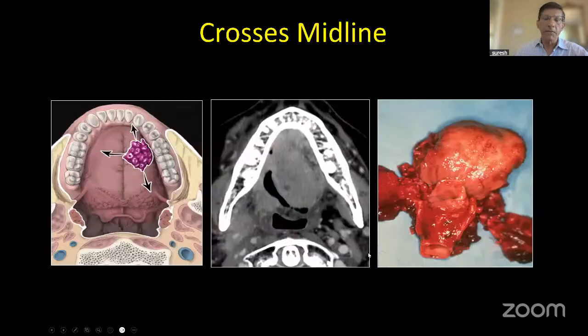But on the other hand, if we have a tumor such as this that's completely involving the tongue, so when we have a tumor like this, we're talking about this spread pattern that crosses midline, then you really have to have an interesting discussion, especially now in 2025. Because if this tumor crosses the tongue, then the surgeons always want to try to get a 5 to 10 millimeter oncologic margin.